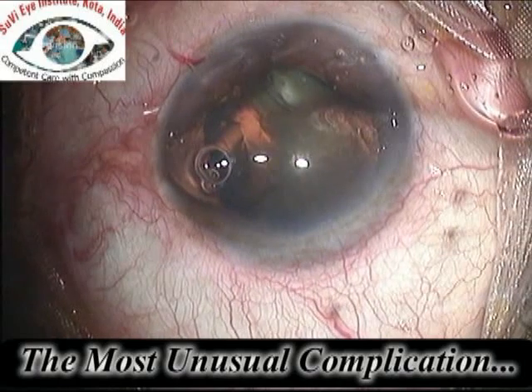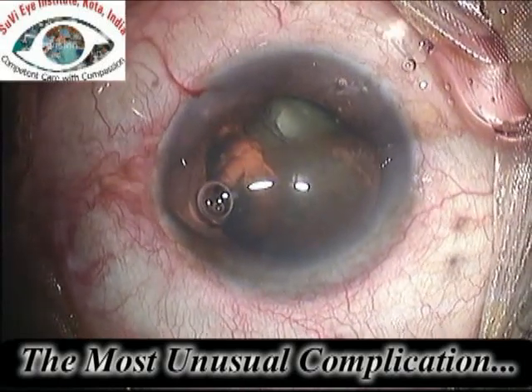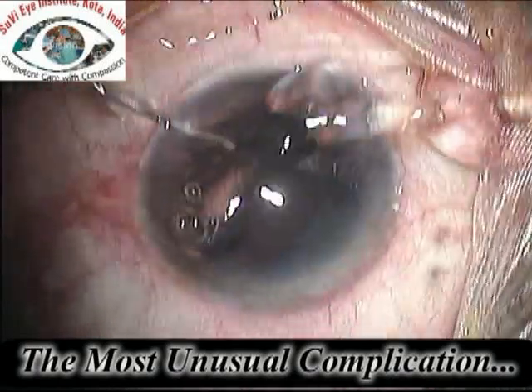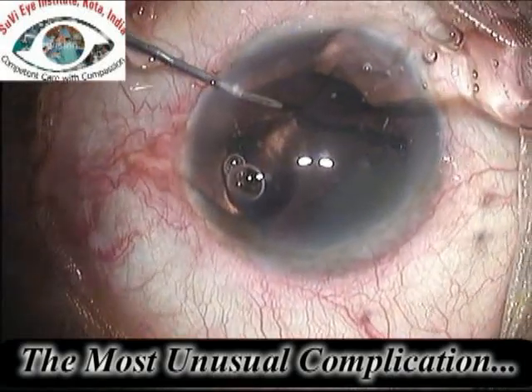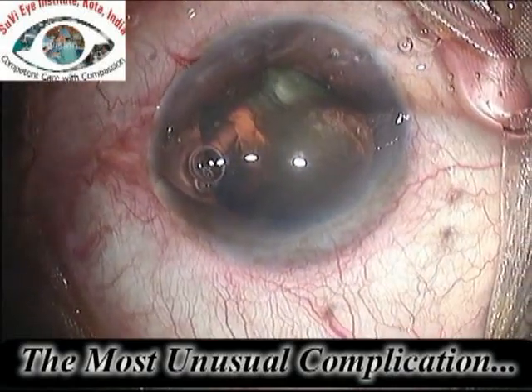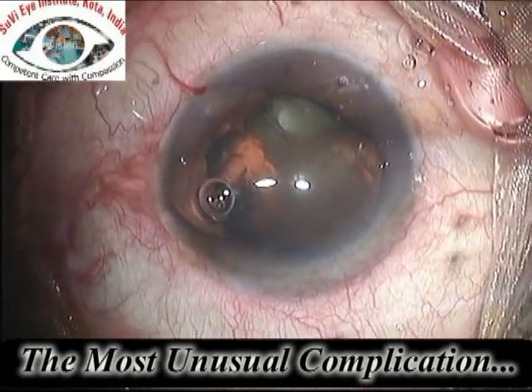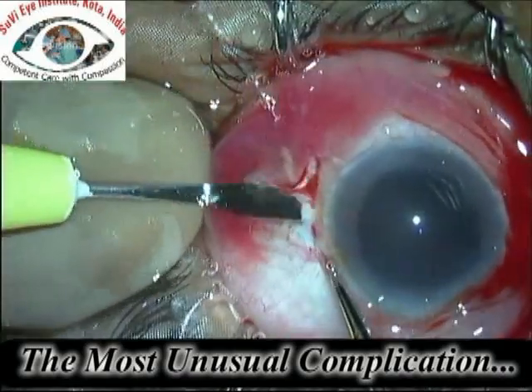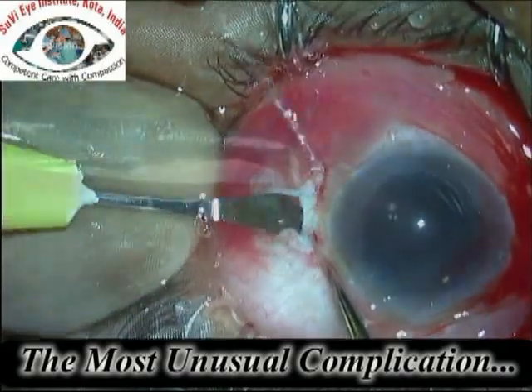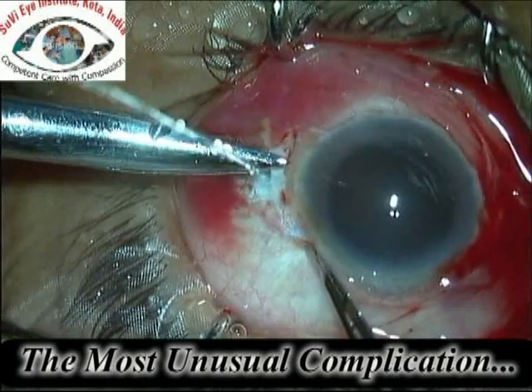The cannula was loosely fit on the syringe. This was a novice assistant, and even though these things are drilled into all the assistants and residents, sometimes these unusual things do occur. As you can see, as soon as the viscoelastic is being introduced, the nucleus drop occurred.